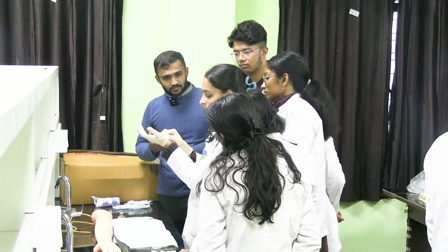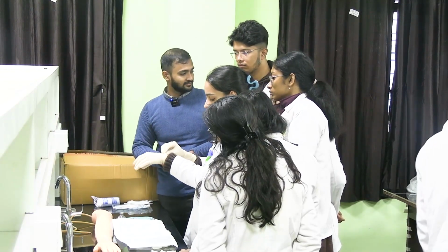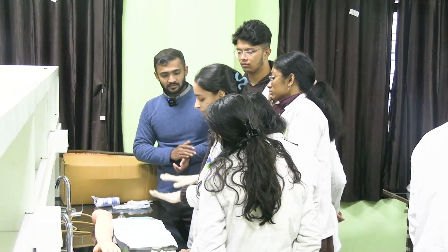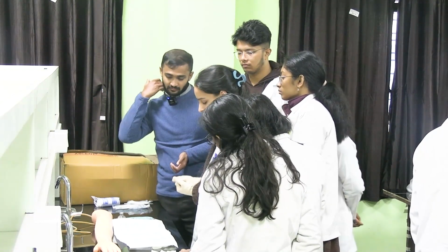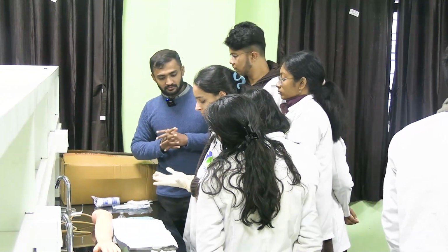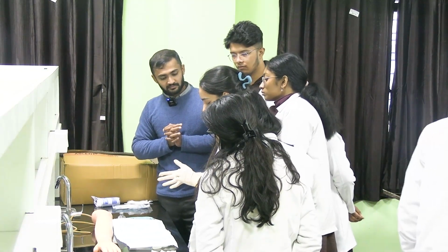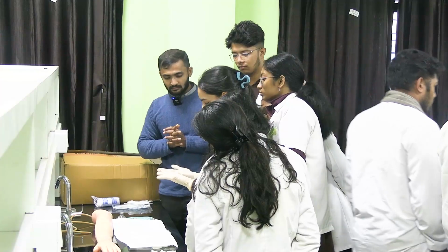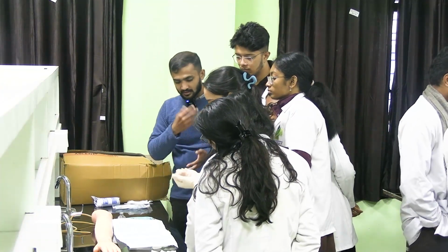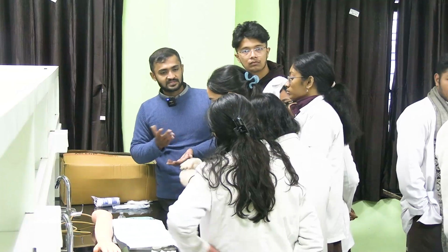So the outer part should always be outer. It shouldn't go in, it should always be the outer side. Okay. As you have worn the gloves, is it fitting you, or is it loose or tight? What do you think? It is fitting. Okay, but I think it should be a bit more fitting. So after wearing the gloves, what is the next step?